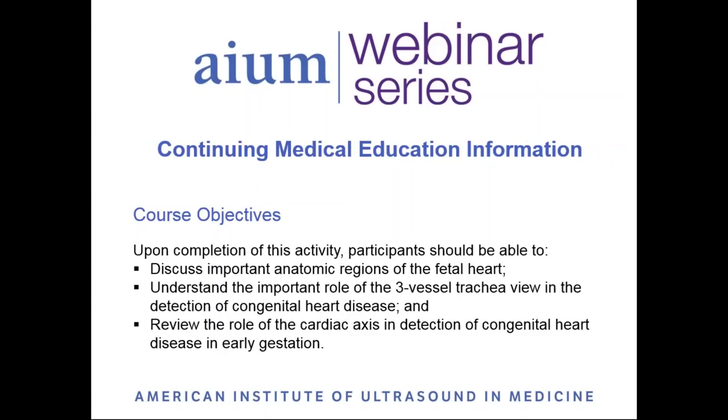At the conclusion of this webinar, participants should be able to discuss anatomic regions of the fetal heart and understand the important role of the three-vessel trachea view and the cardiac axis for detection of congenital heart disease.